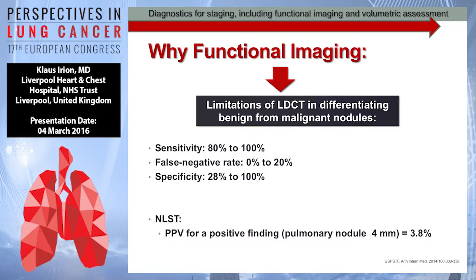So that was regarding pulmonary nodules, trying to identify which ones we should follow, what is growth or not. And now trying to identify which nodules you think are malignant, which nodules you think are benign. Getting rid of those classical patterns of macroscopic fat, diffuse calcification, or central dense calcifications, you know that the CT scan has a poor specificity. It can be as bad as 28% when you try to say if it's benign or malignant.